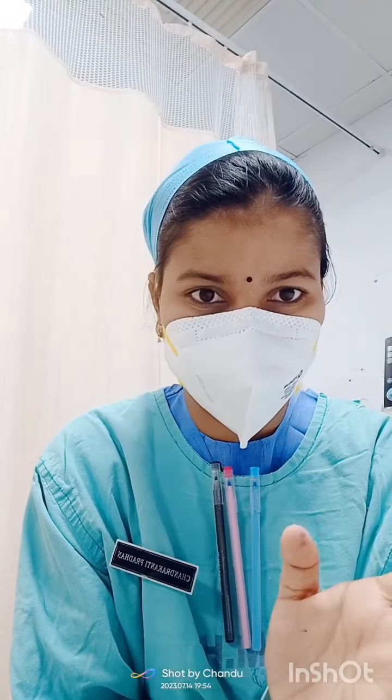The third condition is wide complex stable tachycardia. The example is pulse with VT, VT with pulse. Okay, the patient has a pulse and VT is happening, so at that time the energy requirement is 100 to 200.